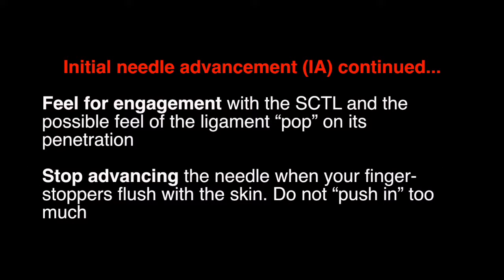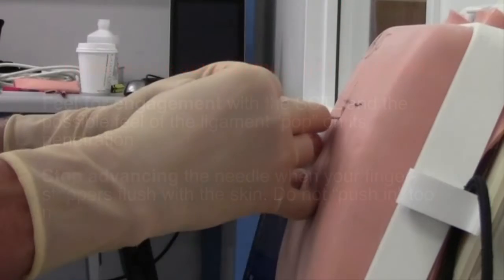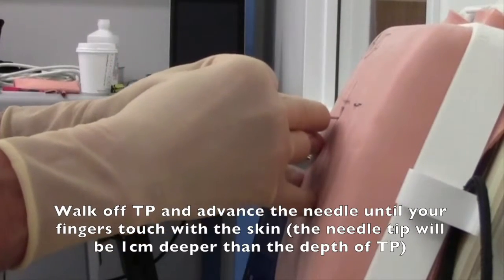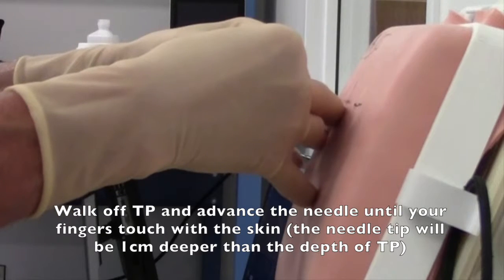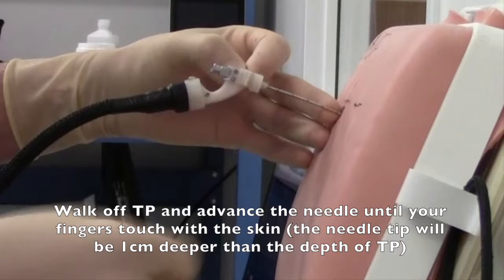Feel for engagement with the SCTL and the possible feel of the ligament pop on its penetration. Stop advancing the needle when your finger stoppers are flush with the skin — do not push in too much. Walk off teepee and advance the needle until your fingers touch the skin. The needle tip will be one centimeter deeper than the depth of the teepee.